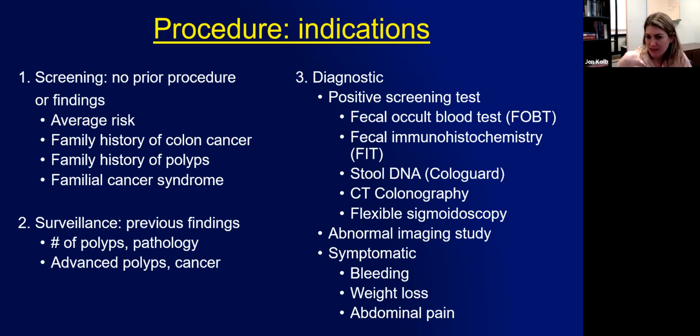But there are also patients who come in saying, I've been having diarrhea, I have some weight loss, I may be having some rectal bleeding, I think it's hemorrhoids, but I think we should take a look. Those are all indications of a diagnostic reason, okay? So those are the major categories for indications, and it's important to keep this straight, to make sure that in the report, when you're explaining to the patient or telling the physician why the procedure is going to be done, we think about the right indication.